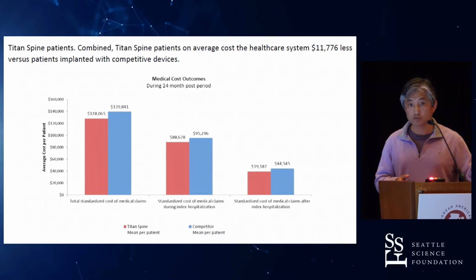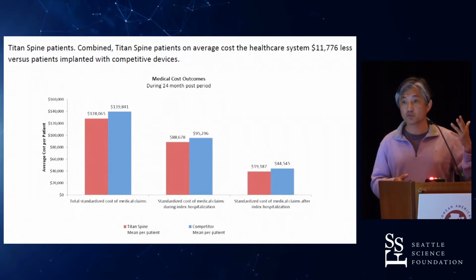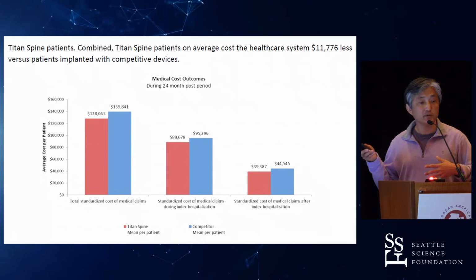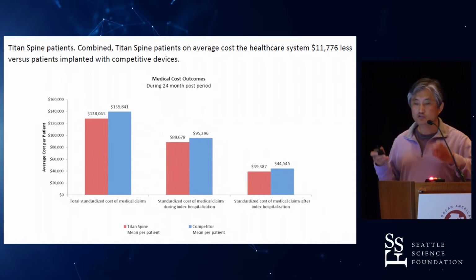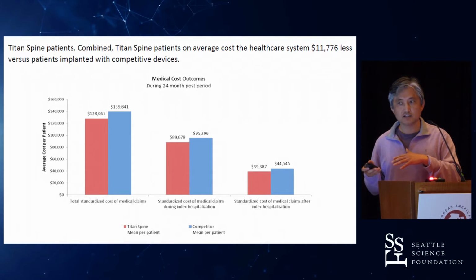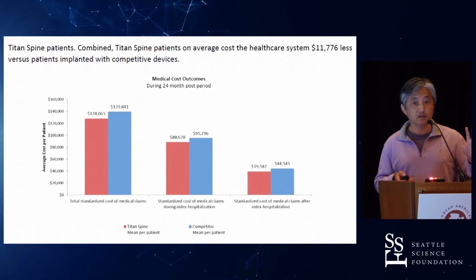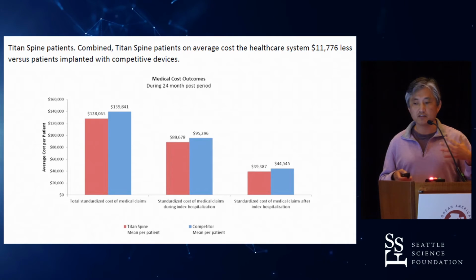The patient stayed in the hospital shorter, they didn't come back with complaints that required medications, injections, whatever it was, and lastly, there was a lower revision rate, secondary surgery, whatever it may be. But perhaps if the companies are able to conduct these studies, or if the insurance companies do it themselves and are able to prove to you that certain devices are better than others financially, then maybe we'll be driven to use these implants in the future. So there's no data out there that says that titanium etched implants, especially from Titan Spine, are far superior and give you far superior fusion rates. But there are some data that are starting to suggest that perhaps clinically and financially it is better.